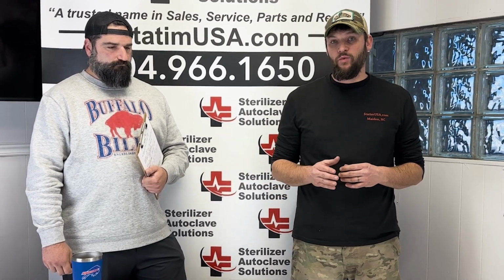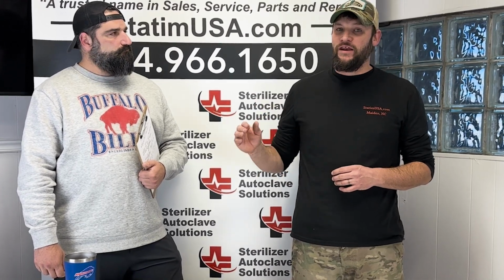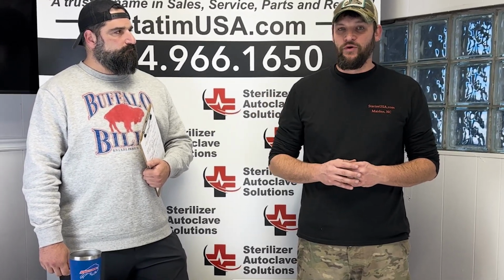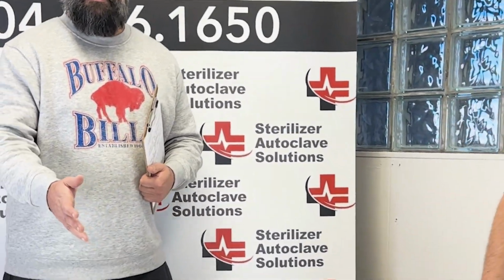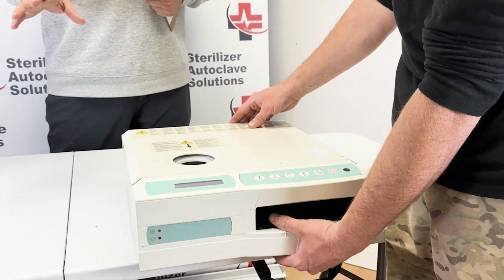Cleaner water will never hurt the Statim, dirtier water will. You can only adjust the low end and change that from 30 parts per million to 10 parts per million. You never want to adjust the high end, which is already preset to 180. If you go above the 180, then that can cause issues for your boiler. So why don't we go ahead and take the cover off? We've already got this kind of preset up to make it a little bit easier, but we're going to take this cover off and Ian's going to go over the water quality piece with you.